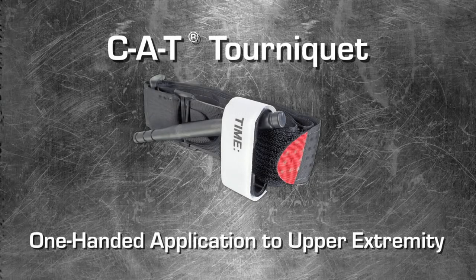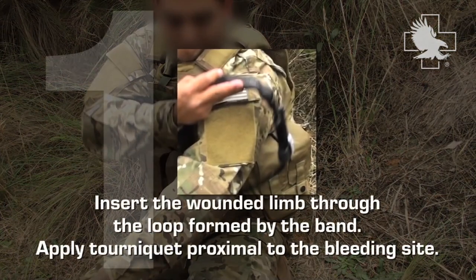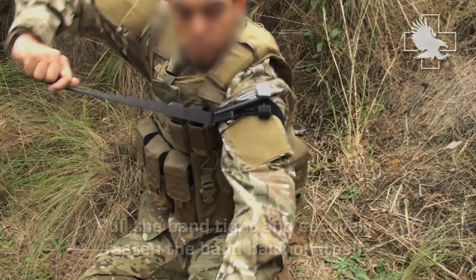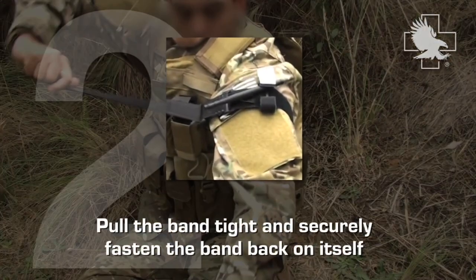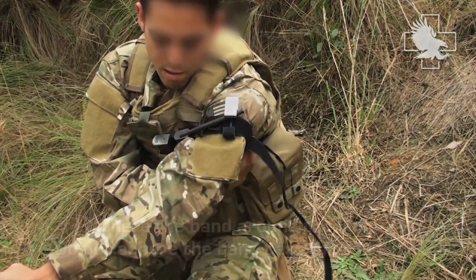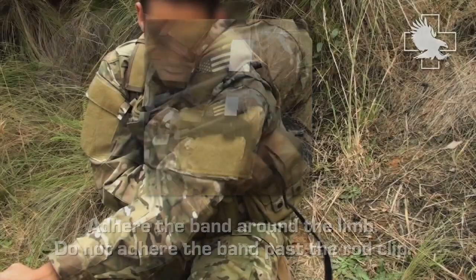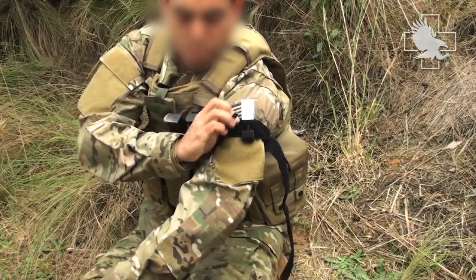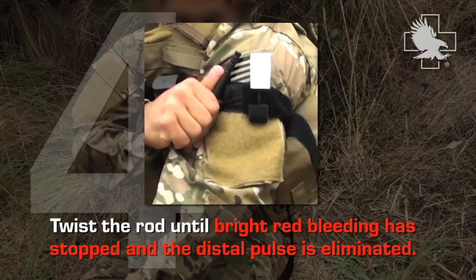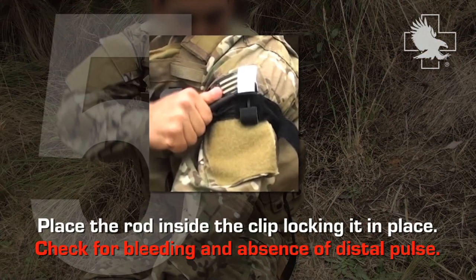Welcome to the CAT tourniquet video tutorial, one-handed application to upper extremity. Insert the wounded limb through the loop formed by the band. Apply tourniquet proximal to the bleeding site. Pull the band tight and securely fasten the band back on itself. Adhere the band around the limb. Do not adhere past the rod clip. Twist the rod until bright red bleeding has stopped and the distal pulse is eliminated. Place the rod inside the clip, locking it in place. Check for bleeding and absence of distal pulse.